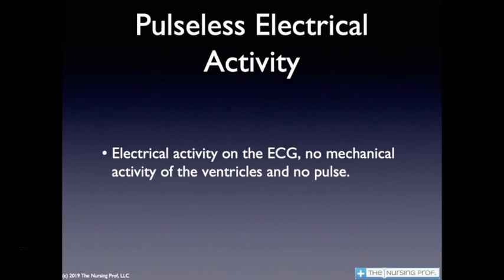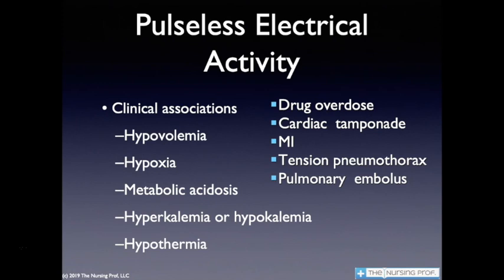Another situation that can occur is called pulseless electrical activity. In this situation here, we have electrical activity of the heart, but there's no mechanical activity. All right, now I want you to think about this for a minute. Electrical activity and mechanical activity are two separate things. We can have electrical activity of the heart, but the heart doesn't respond and contract. Some reasons for that could be severe hypoxia, hypovolemia, severe electrolyte disorders, or we may have things that are impacting the myocardium.